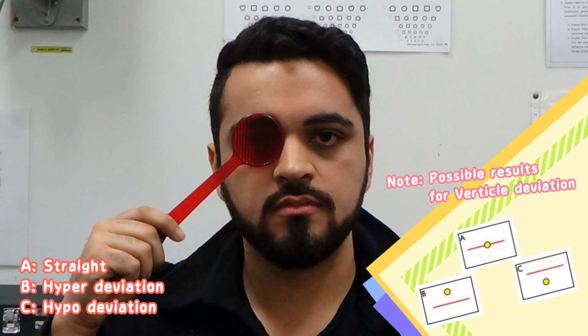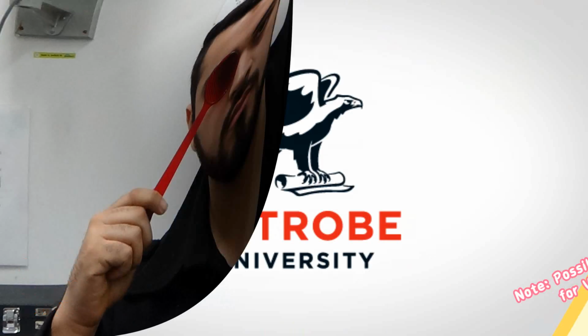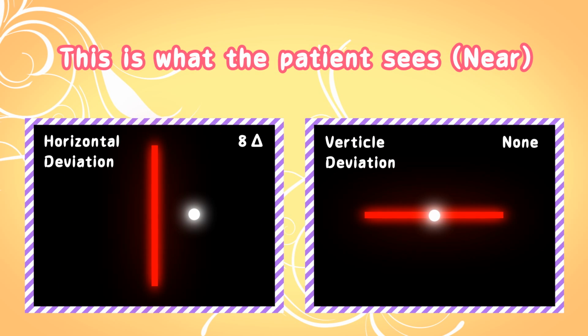To measure the vertical deviation at near, the patient is asked to hold the Maddox rod in front of their right eye with the cylinders vertical. Therefore, the red line will now be horizontal. The patient is asked whether the white light is superimposed on the red line or if it is above or below the red line. In this case, the patient has indicated that the white light is superimposed on the red line, meaning that they have no vertical deviations.